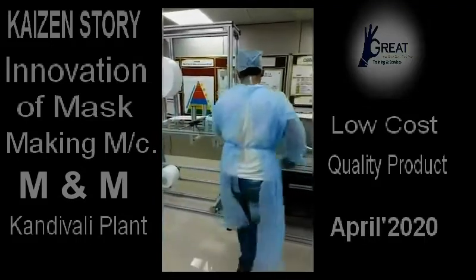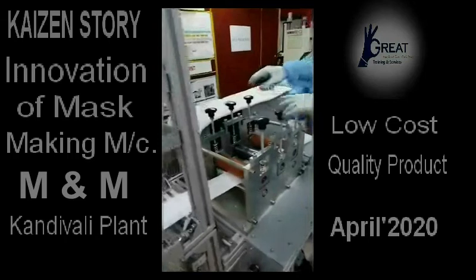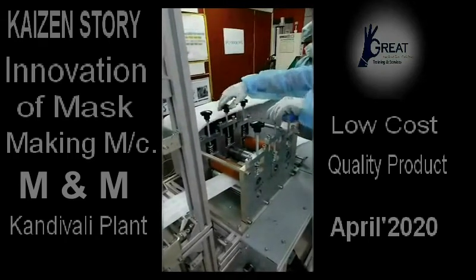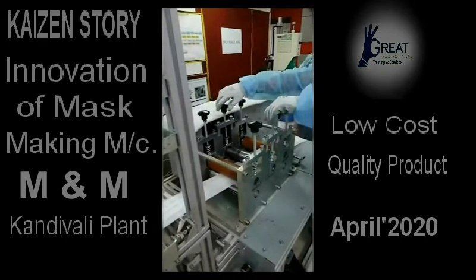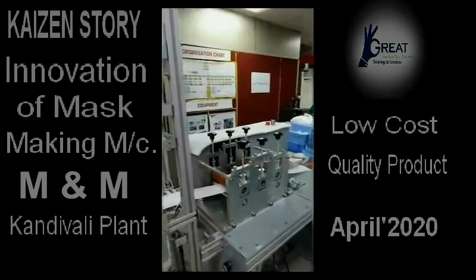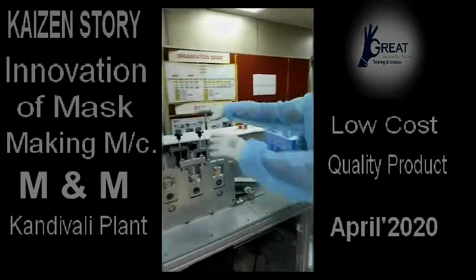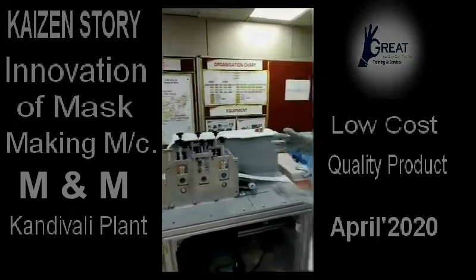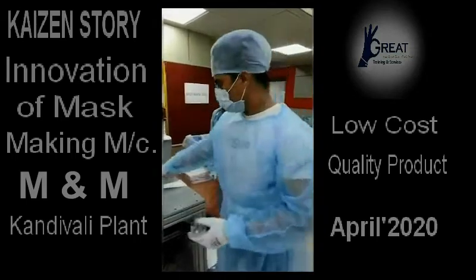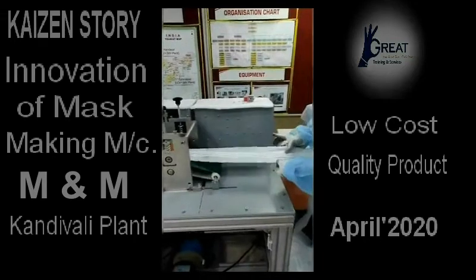From there it goes to this ultrasonic unit. We can adjust the depth of all these dots which appear here. There is an ultrasonic horn which creates frequency with amplitude, and with the help of this pressure and frequency, it creates sealing — ultrasonic sealing — right here. And now we are getting the final product here like this.